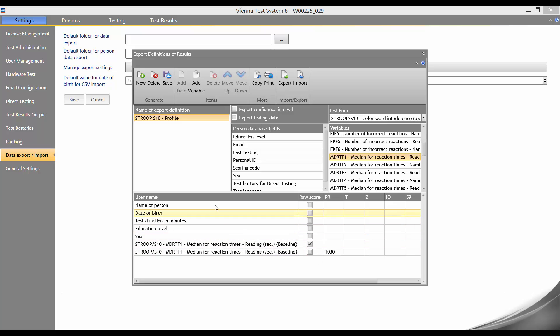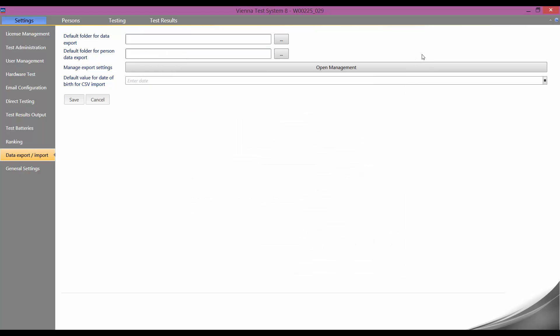We now save the export profile by clicking on save here in the menu. Our export profile is now set up. We now close the profile management and go back to the test results tab.